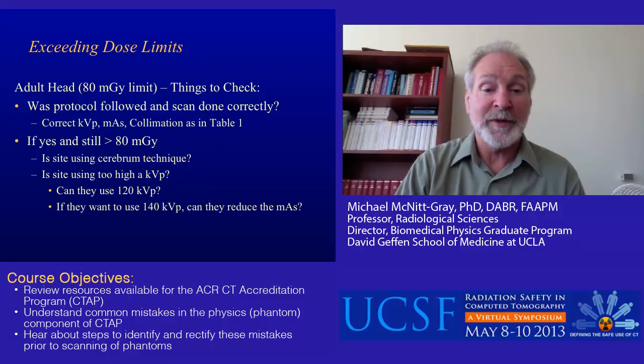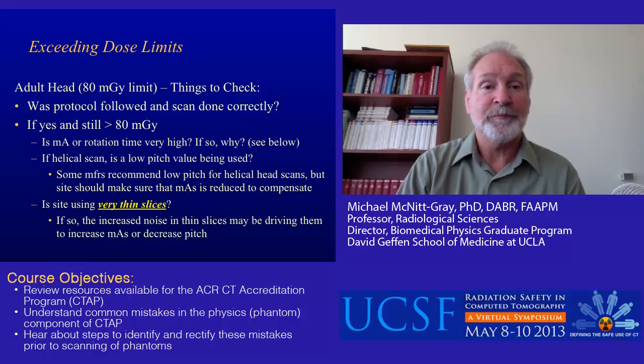This is not for specialty exams. This is for just a routine standard adult brain technique. Next. Okay. If these values are still exceeded and still greater than 80 milligray, a few more things to check.